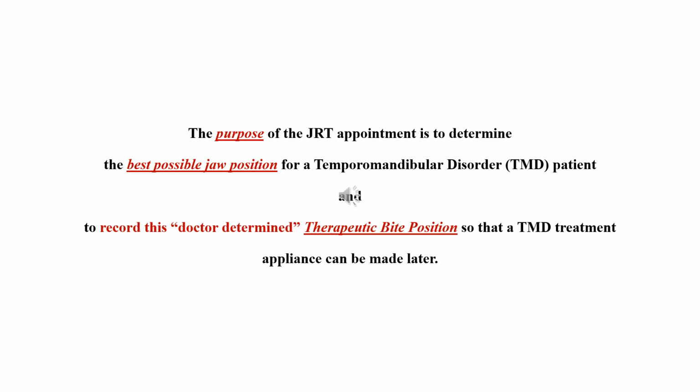In other words, it's to find out if this is the right position. So I'm making an educated guess, but I'm going to verify, find the truth, that this is indeed the correct bite position, and most of the time I'm correct. Very, very few times have I had to go back and change the bite position and make a new appliance.